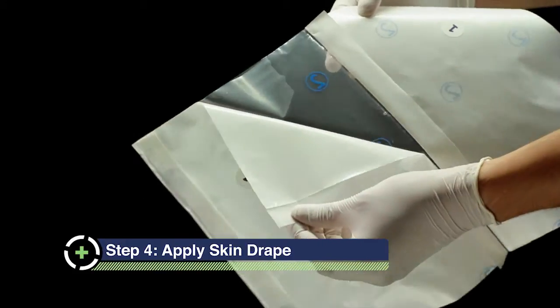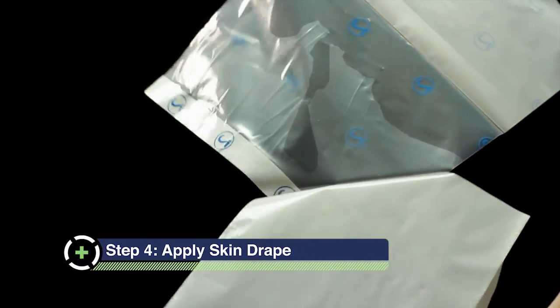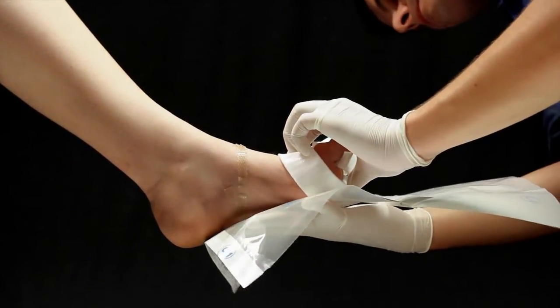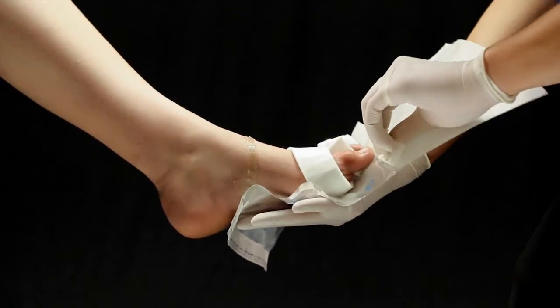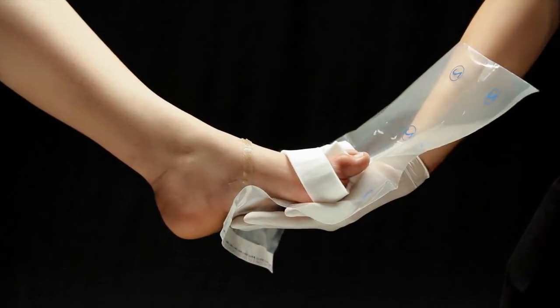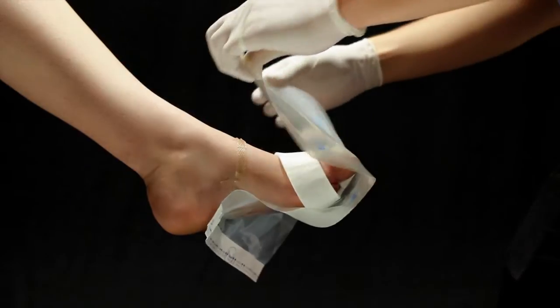Remove the film drape from the packaging and apply it over the foot by peeling back one side of the first layer. Then have the patient step onto it so that the toes face the fold and the adhesive covers the gel strips located on the foot. Leave extra room at the tip of the toes to prevent tension on the toes. Remove the remaining side of the first layer and fold over the foot.